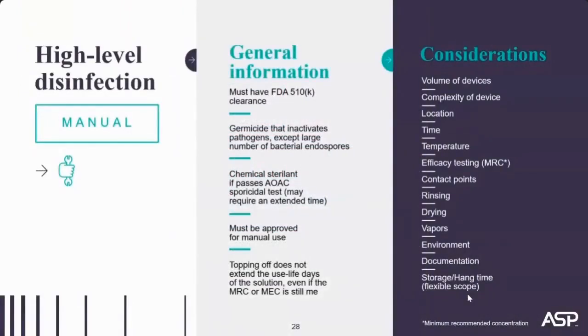Are you manually high-level disinfecting? One of the challenges with manually reprocessing is there are a few, if any, automated steps. And so depending on who is doing it and the supplies they have at their disposal could determine the outcome in getting either a high-level disinfected scope or a contaminated one.